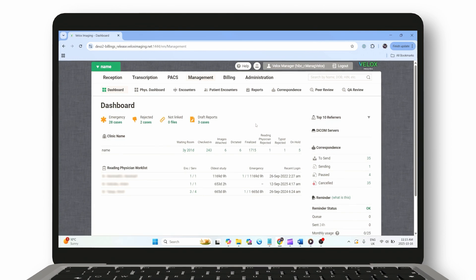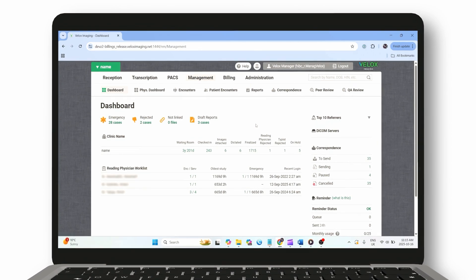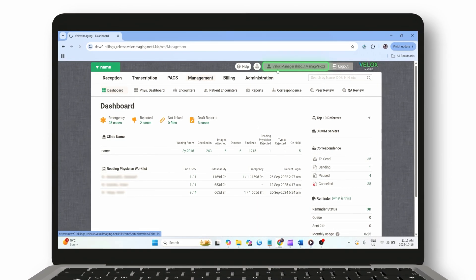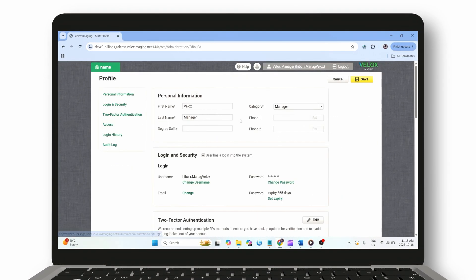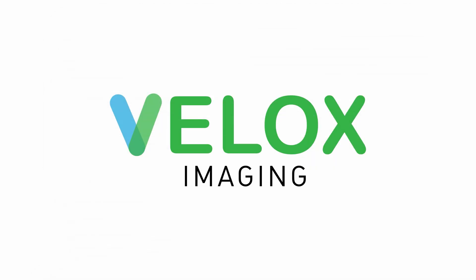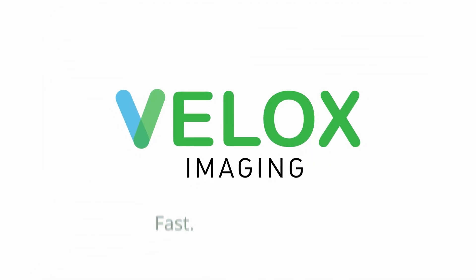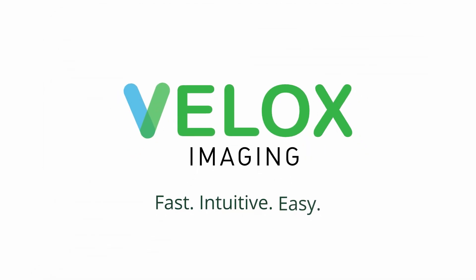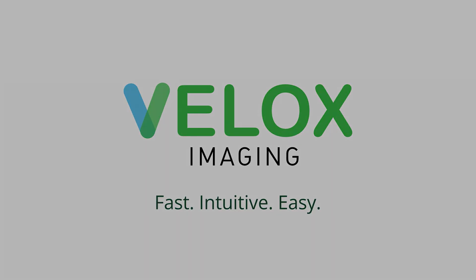At any time, you can update your two-factor authentication settings by clicking your name in the top-right corner of the screen and selecting Account Settings. Thank you for choosing Velox Imaging. With two-factor authentication enabled, your account and your data are safer than ever.